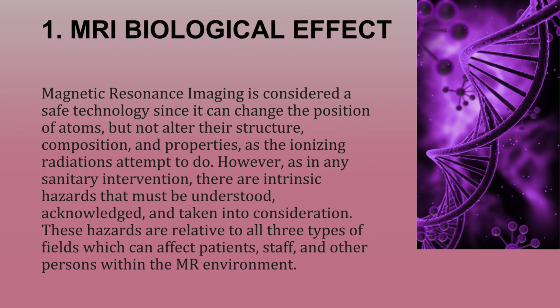First, MRI biological effect. What are biological effects? MRI is considered safe technology since it can change the position of atoms but not alter their structure, composition, and properties as ionizing radiation attempts to do. However, as in any sanitary intervention, there are intrinsic hazards that must be understood, acknowledged, and taken into consideration. These hazards are relative to all three types of fields which can affect patients, staff, and other persons within the MR environment.